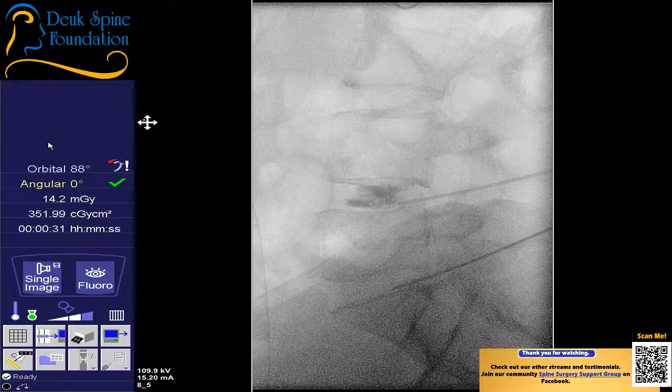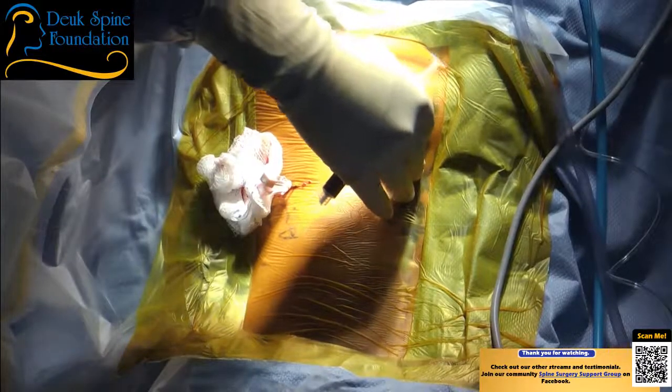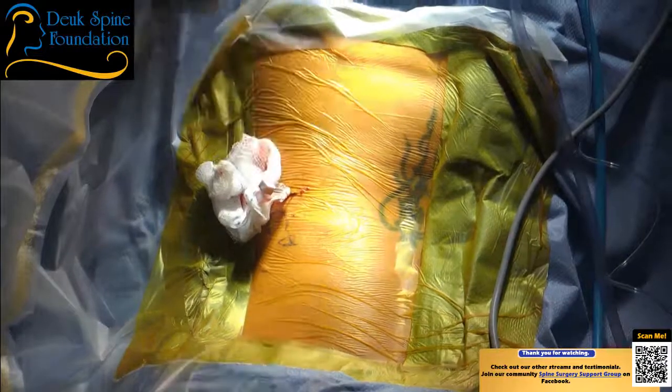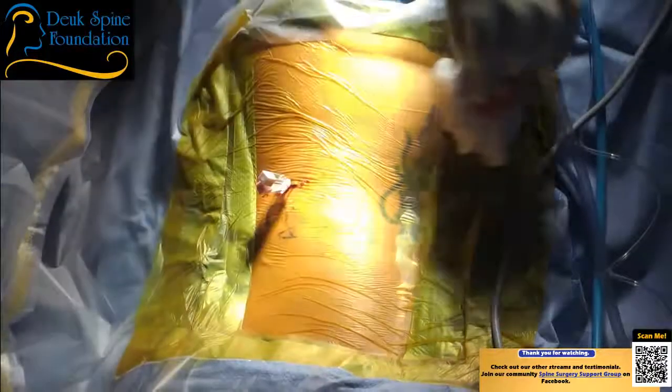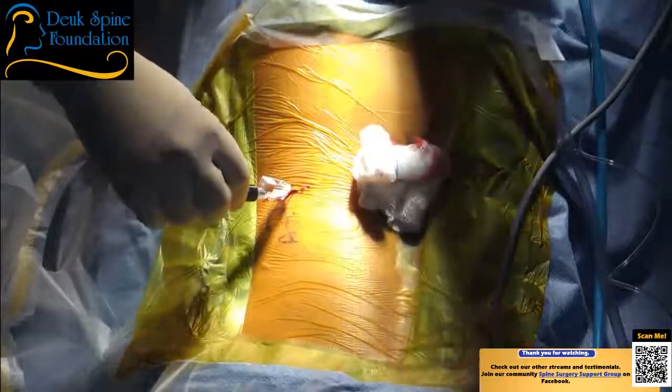So I'm using the topographic localization of her pain on exam because the truth is discogenic pain is transmitted to the brain somatotopically through a somatotopic pain pathway through what are called sensory afferents, all right, somatosensory afferents, and that's why it can be so highly localized for the patient where the pain is. And then of course the MRI, and now we just confirmed the pain at L4-5 with the discogram. We just tested the disc and it's causing her typical back pain, 10 out of 10.